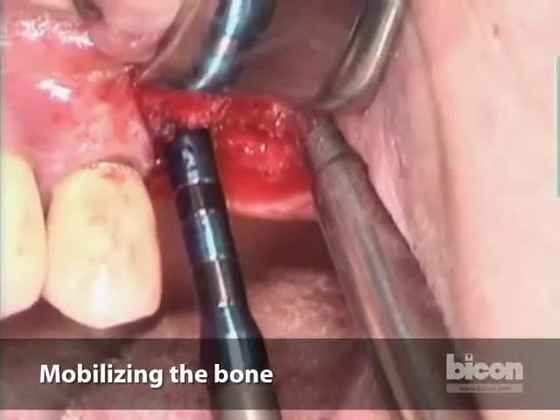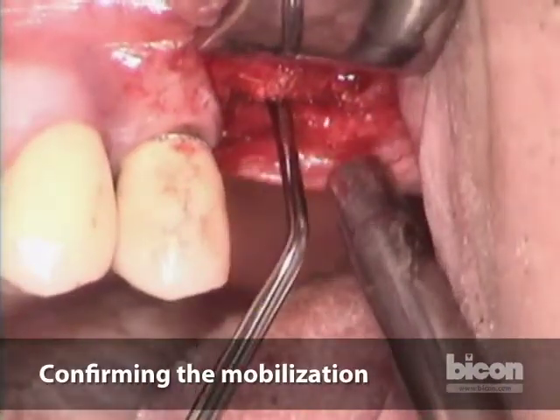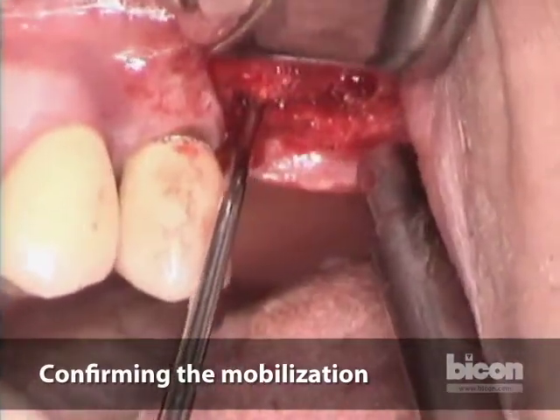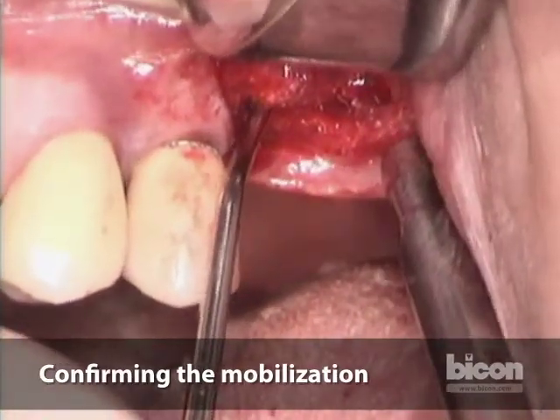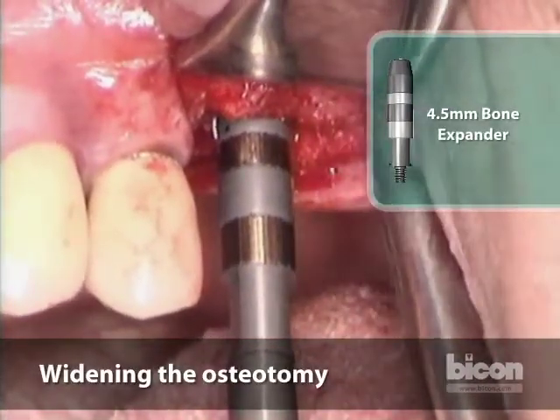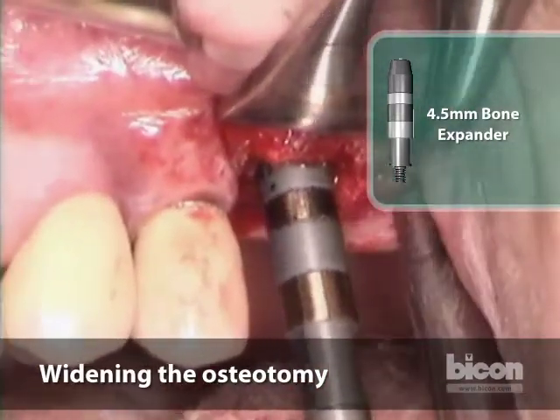Here we go — making sure that we are underneath the sinus mucosa, and we are. We are now up to four and a half, but the bone is pretty solid. Because this ridge is so wide, I will go a little bit wider — I'll go to six millimeters in diameter.